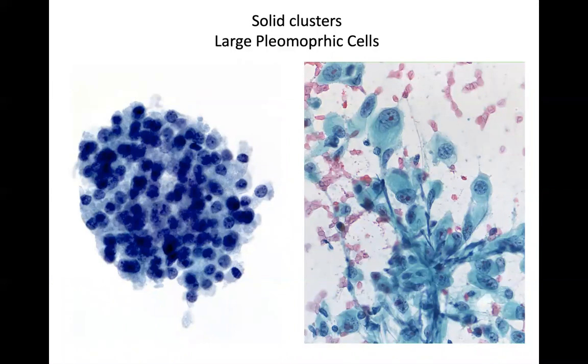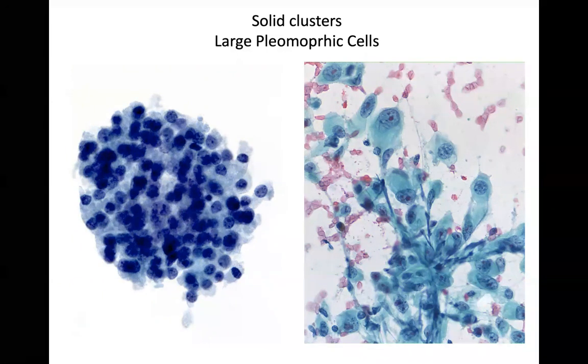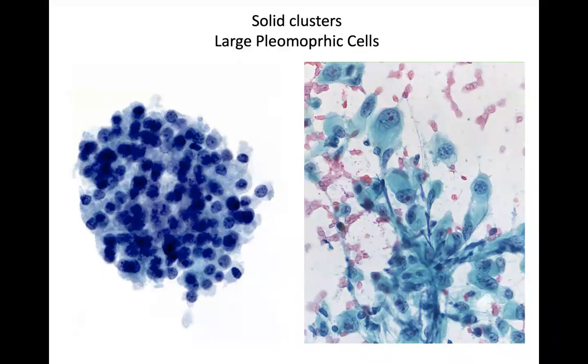All right. And the last case is showing clusters of large pleomorphic cells with wispy cytoplasm, with large nuclei, with prominent nucleoli. Not phrased as a question. What is anaplastic thyroid carcinoma? So highly possible. So this goes into our probably malignant, but something else category, right?